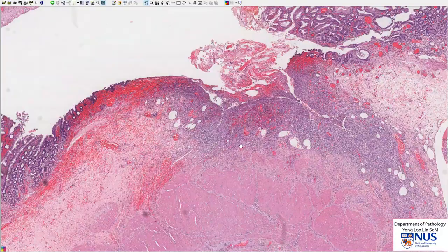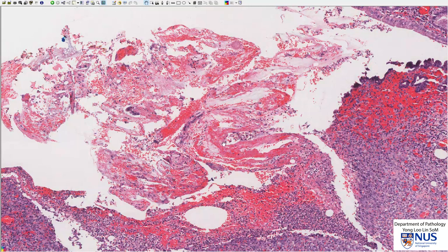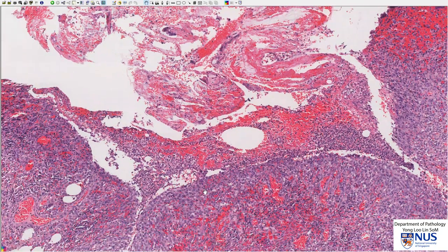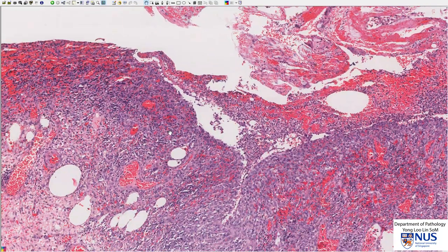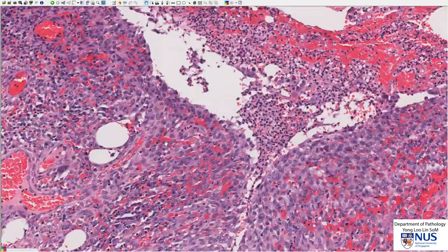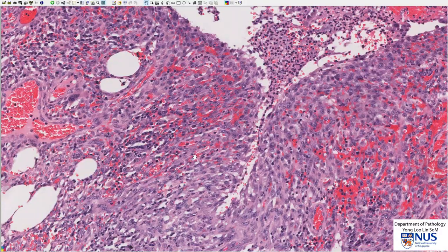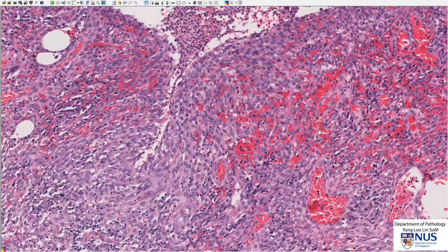Let me zoom in. Again, we can appreciate the fibrino-inflammatory exudate. We have some necrotic tissue, which is not so clearly seen in this particular ulcer. But we have lots of newly formed blood vessels here, and some of them are leaky — you can see the red blood cells have actually extravasated out of the blood vessels. This is the zone of granulation tissue.